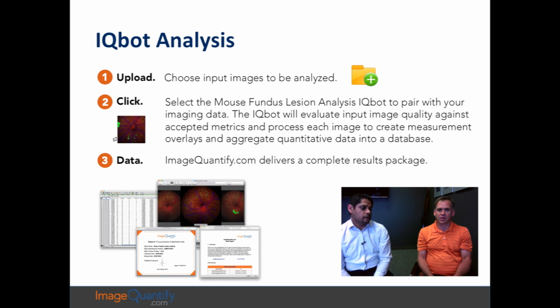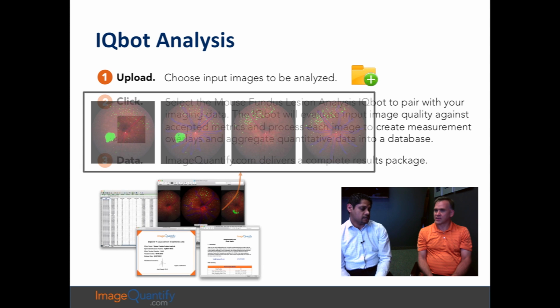Yeah, these are output images from the actual algorithm. It runs an image, and it spits out the overlay of where all the lesions are. It also spits out an image that shows you where it segmented the optic nerve and the vessels. And then it puts those together too. The vessels and the optic nerve are in blue, and so you can see it and compare it to the data that you have in the Excel sheet. You can also validate whether the algorithm worked or not.